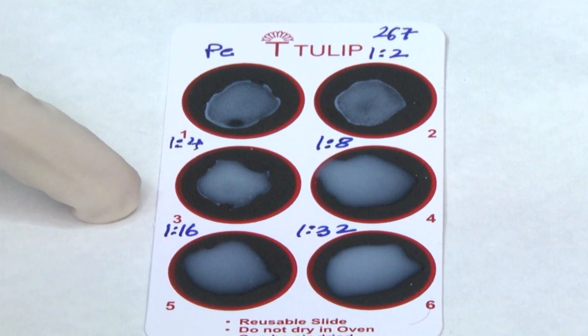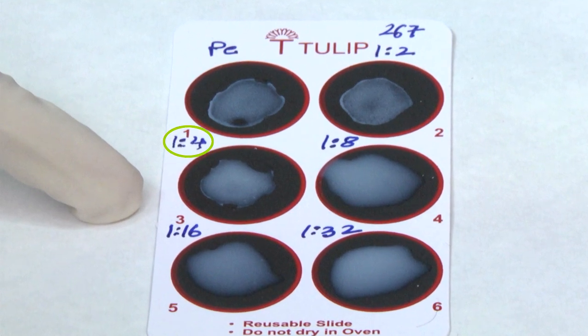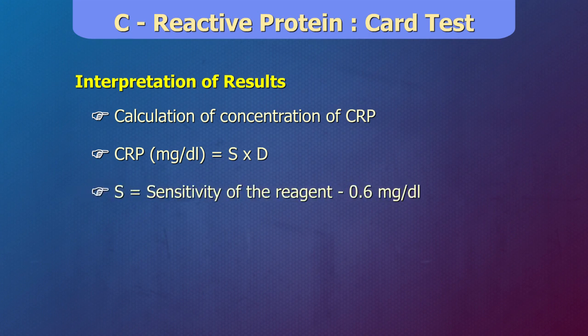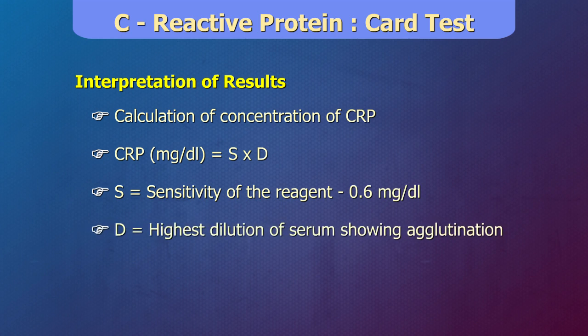Agglutination in the highest serum dilution corresponds to the approximate amount of CRP in milligrams per deciliter present in the test specimen. Concentration of CRP can be calculated as follows. CRP in milligrams per deciliter is equal to S multiplied by D, where S is the sensitivity of the reagent, that is 0.6 milligrams per deciliter, and D is the highest dilution of the serum showing agglutination.